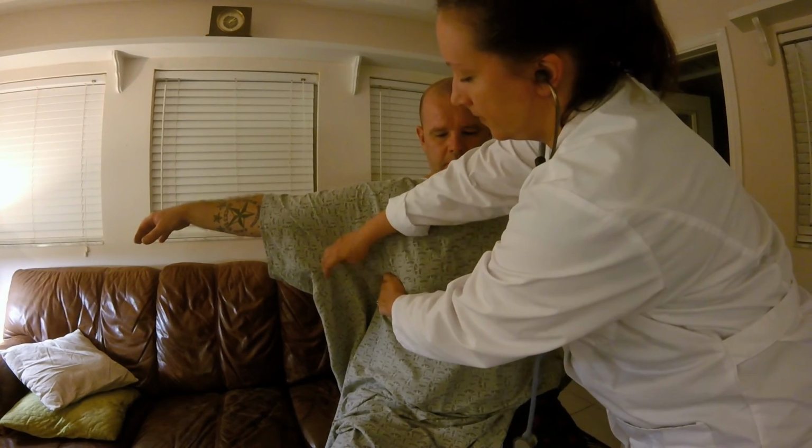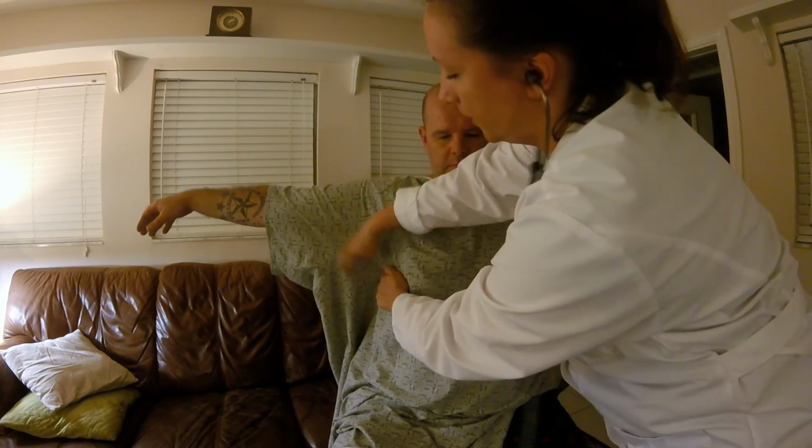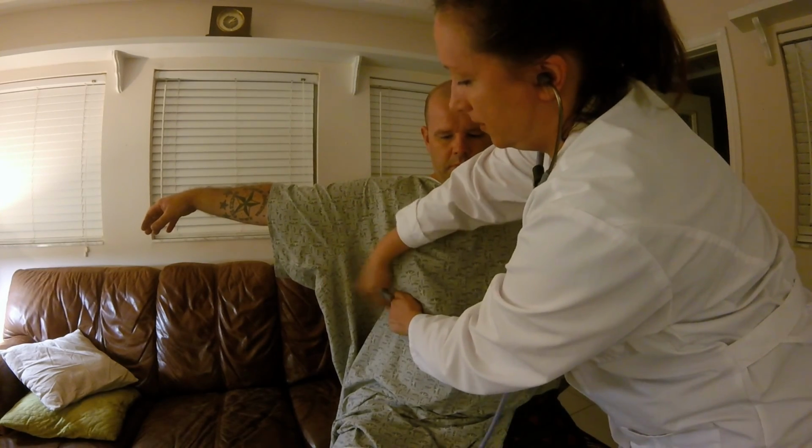One of the assessments that I inadvertently left out, I would like to listen to the lateral portion of your lungs. Would that be okay? And that way I can compare them. Are you able to hold your arms out for me? First thing I'm going to do is go ahead and percuss. There we go. Let's redo that side. Now I'm going to go ahead and breathe. Nice big deep breath. Do it again.